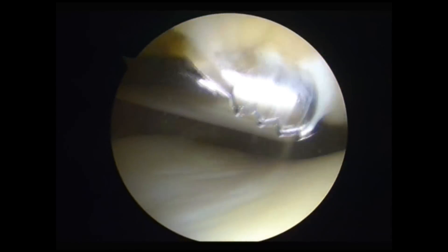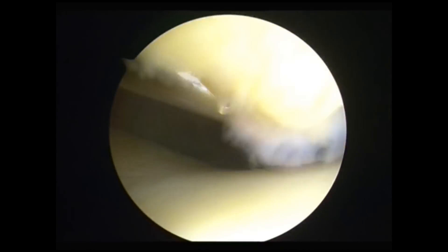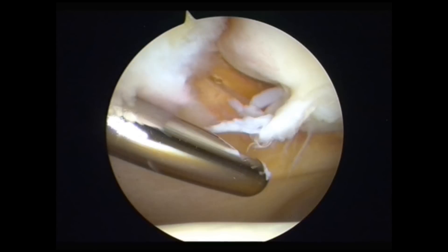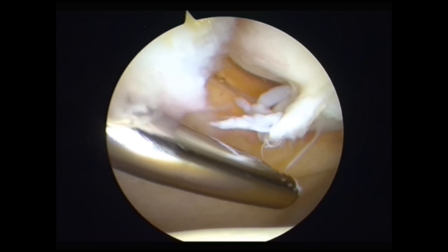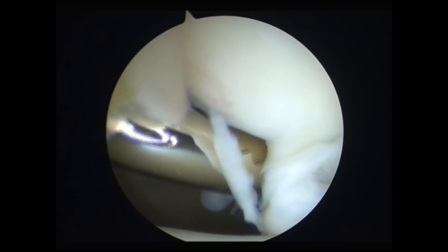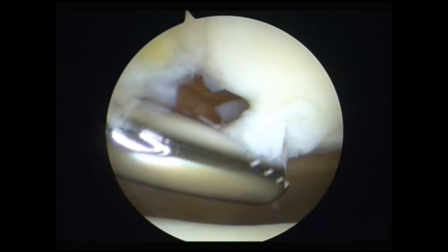Once I've finished with this bit of Hoffa's fat pad and opened it up, the next thing to do is to deal with that fibrillated bit of articular cartilage. The incisor is there for dealing with the larger amounts of tissue, removing them much more quickly than anything else.